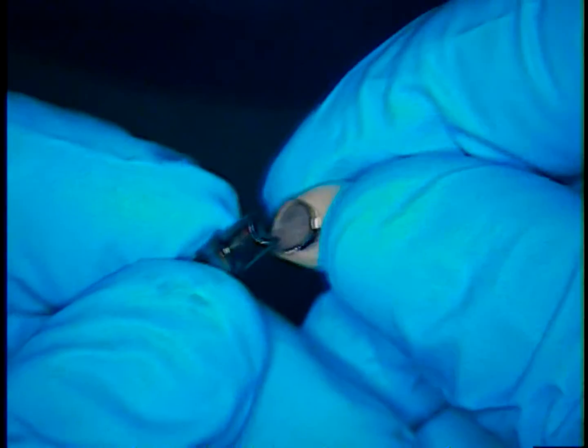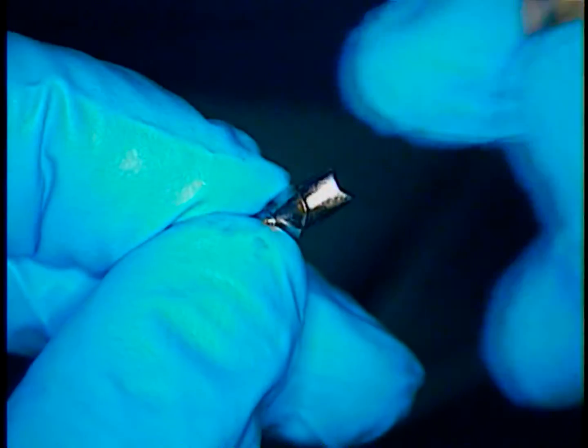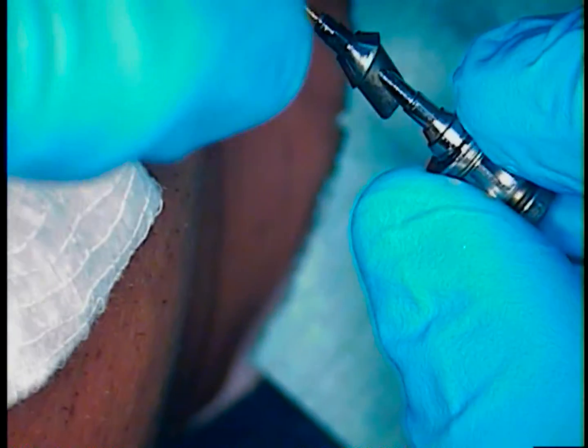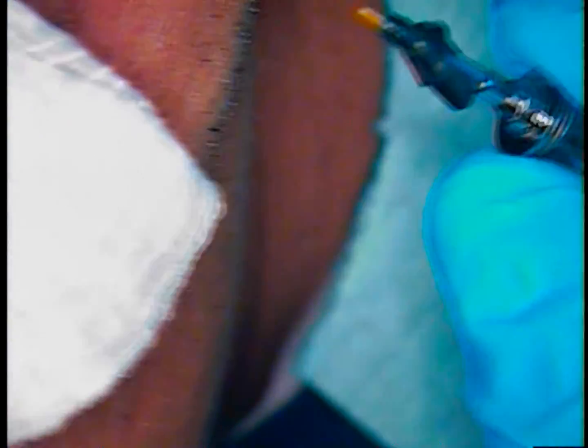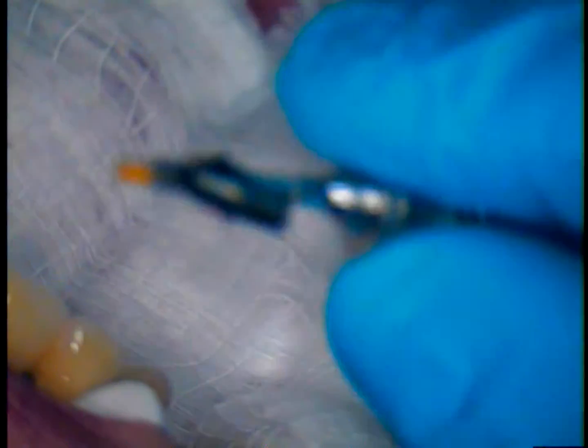That's all you need for this particular screw. So let's retry our crown and abutment. Now we know everything is highly polished — we've got a nice, highly polished collar coming off of the abutment. I did not polish the part of the abutment that goes into the crown; we want as much retention as we can get from the temporary cement. Here's the driver. I'm going to go ahead and insert that now. We have that fishnet — that 2x2 gauze — up there to make sure nothing falls down into the patient's mouth, and plenty of cotton to hold the lip out of the way.